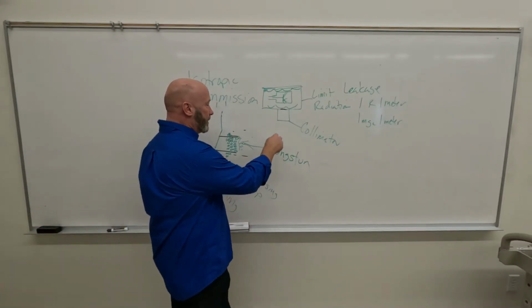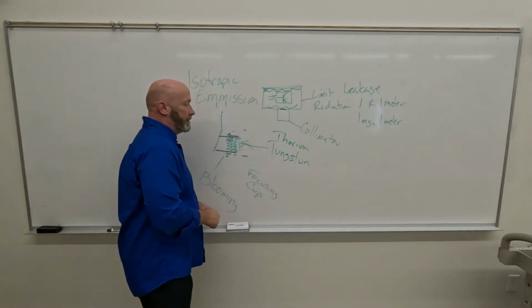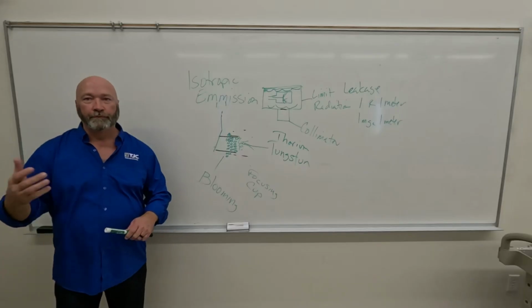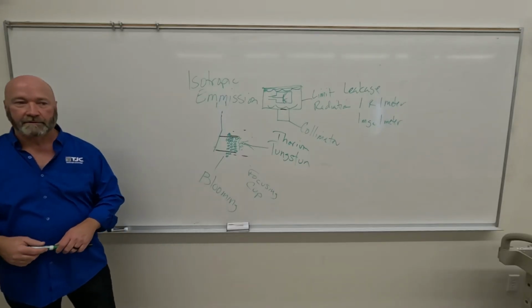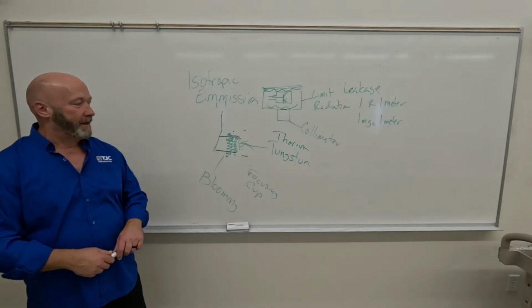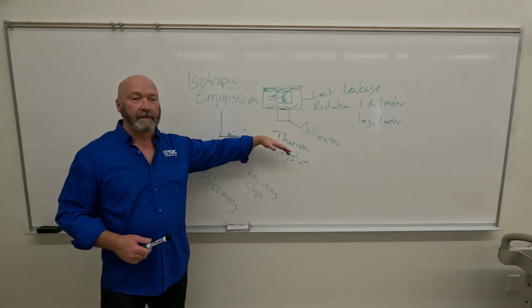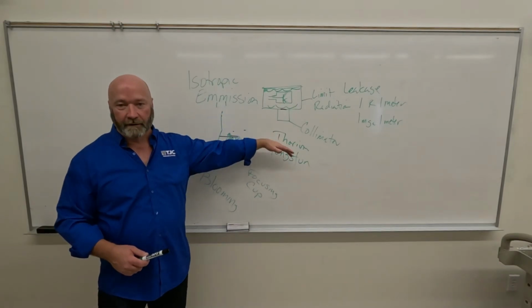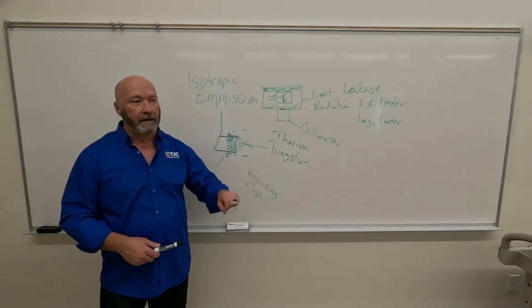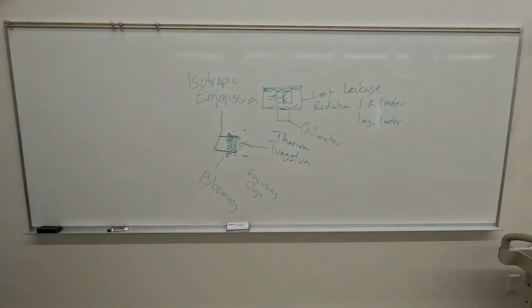It's got a little bit of thorium in it. So Bushong says that the thorium improves thermionic emission, which it probably does. He's smarter than I am. It doesn't take a lot, but he's probably right. But the other thing it does is it gives stability to it. It's less brittle with a little bit of alloy. Right? Okay. So, where else do we use tungsten?